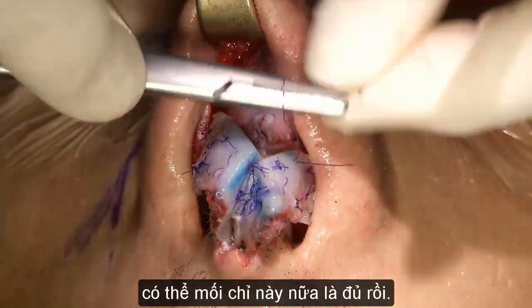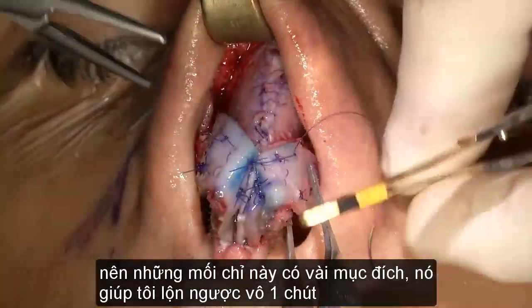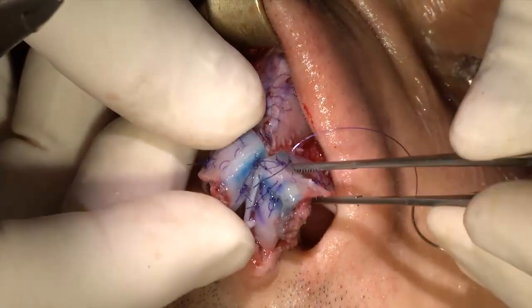I think probably this one is enough. So this suture serves a few purposes. It's helped, well, yes, he's showing that it helped evert the tip a little bit, so to some degree.